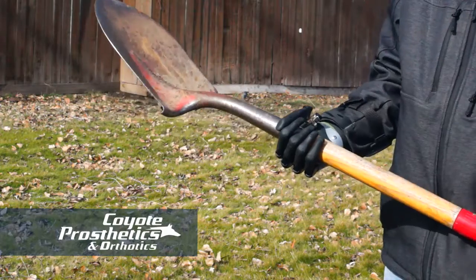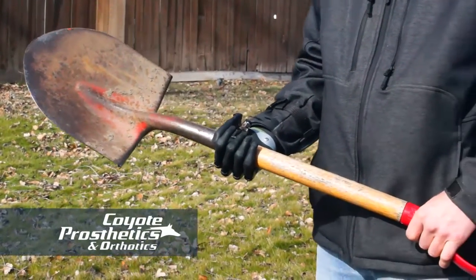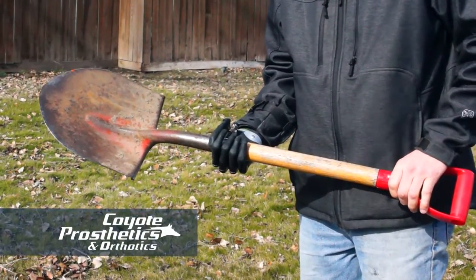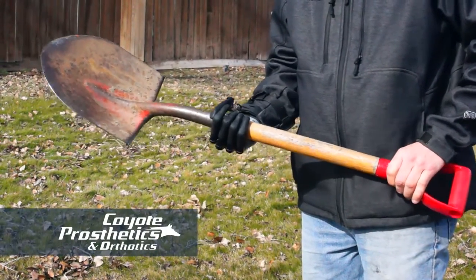I can hold a shovel, as long as I don't have a real rough dirt bed that I'm trying to shovel, or as long as I don't get real aggressive with the shoveling — it will hold the shovel and assist really well.